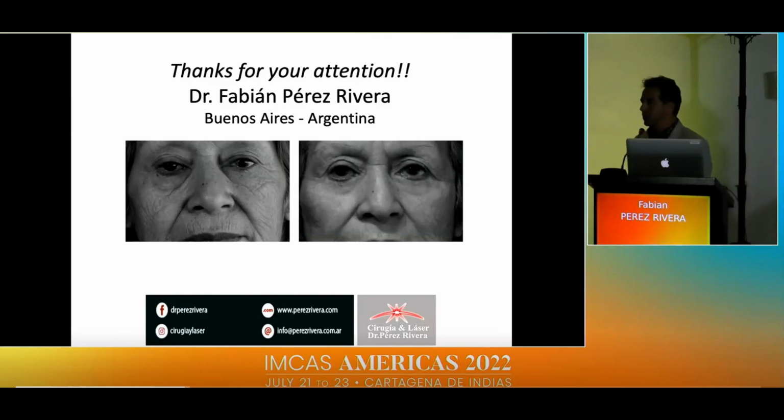Okay, and just one last question for me. How do you manage the timing? Because we know that EBD has some impact on HA or even fat grafting in the area. So are you starting with EBD, a laser, for treating? Same as Steven. If I perform a filler, synthetic filler or fat filler, I try to wait no less than 3 months before I start doing EBD. And if I use microneedling, more time, because I go really deep inside the skin and I can destroy my work. I can destroy my filler. Okay, thank you.